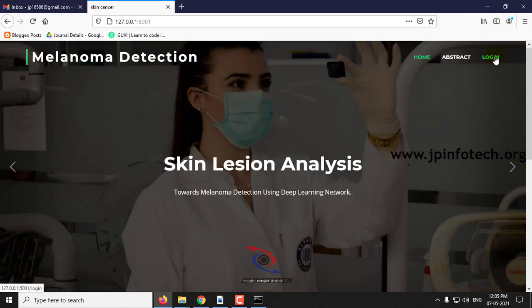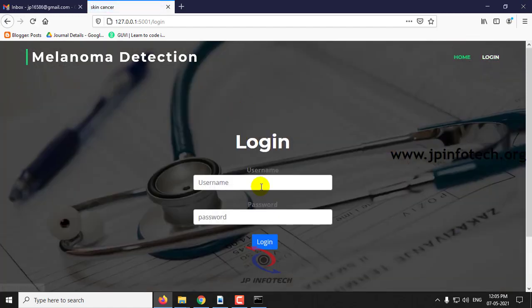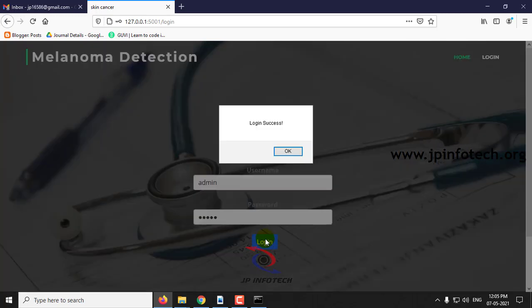Click login. This is a static login with a static username and password — admin — and click login.